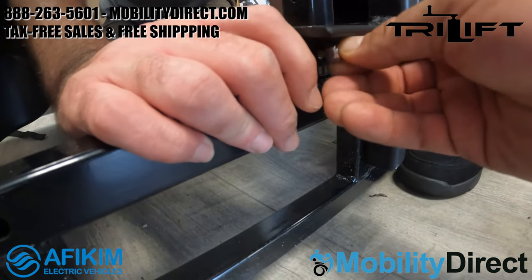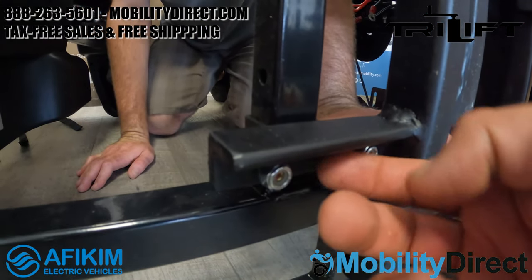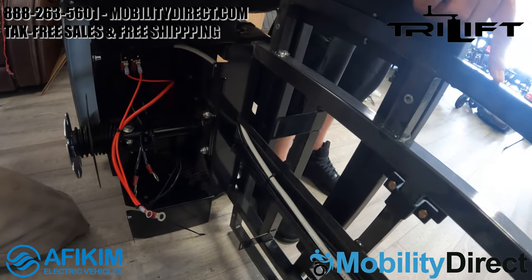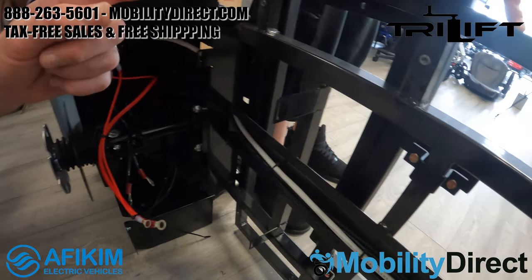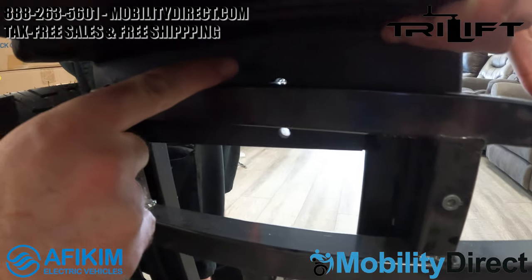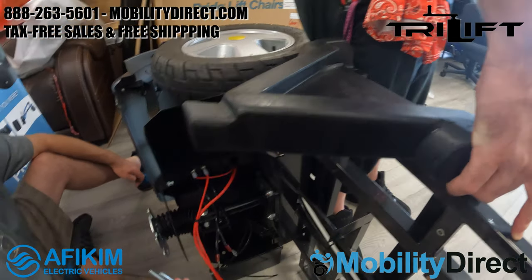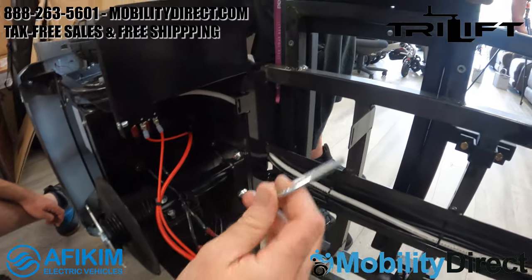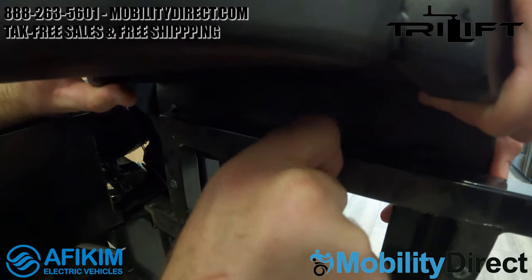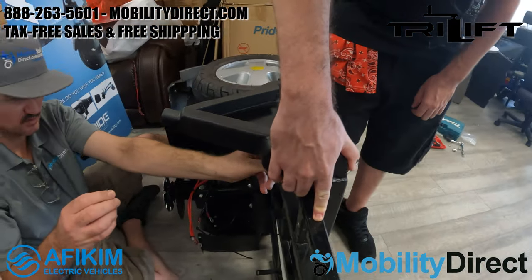We're just putting all the hardware together, keeping it finger tight for now. Once you have everything finger tight, it should hold the bracket in place and then you can come back and start tightening everything down. We do need to install the u-bolt which comes in the hardware package with your tri-lift bracket. That u-bolt is going to go right below the triangle bracket that goes on the left side of the scooter — it's important that you keep this triangle bracket on the left side.